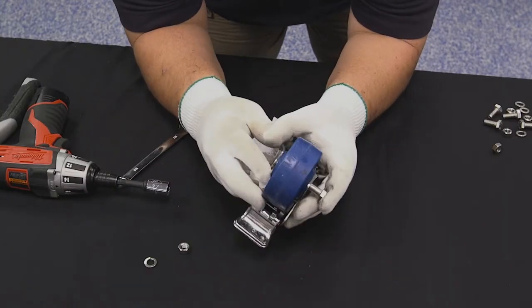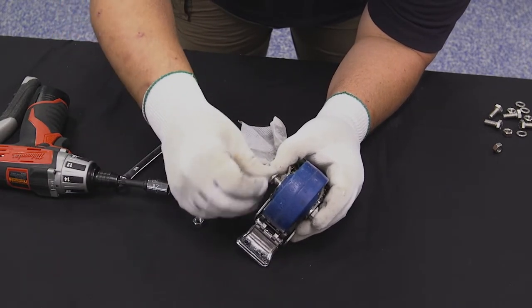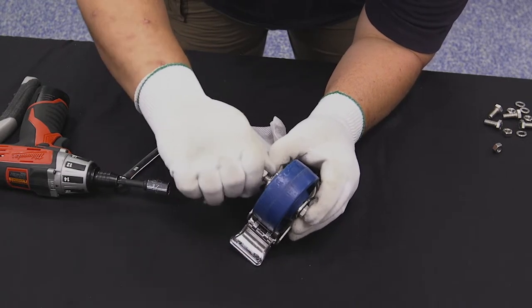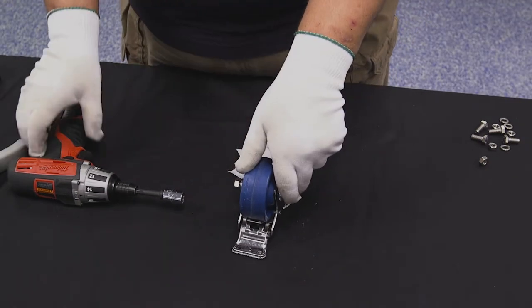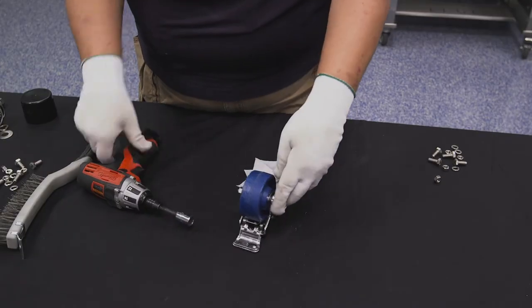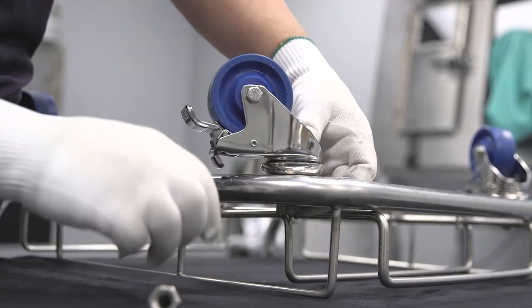To reassemble, place the wheel into the caster fixture and insert the axle. Note that you must install the kingpin bolt in the swivel fixture before installing the wheel. Put your washers back onto the axle. Hold the axle shaft head with a 1/2 inch wrench or channel lock pliers. Thread the nut onto the axle and hand tighten with a 1/2 inch socket. Tighten the acorn nut onto the swivel caster assembly. Reinstall the casters onto the trolley base.